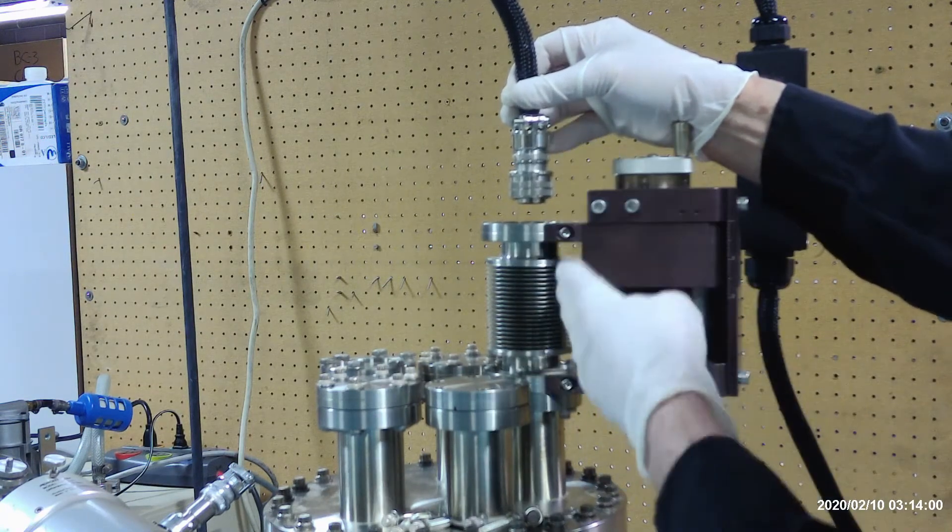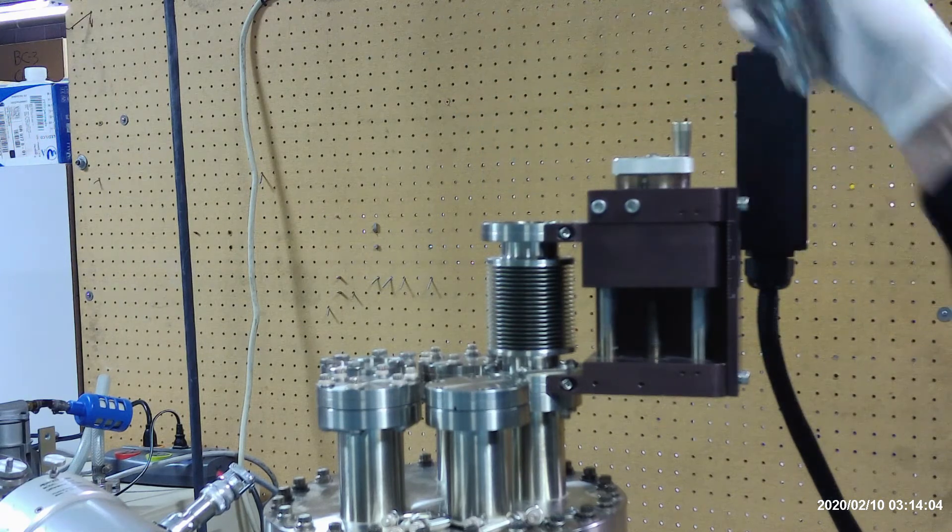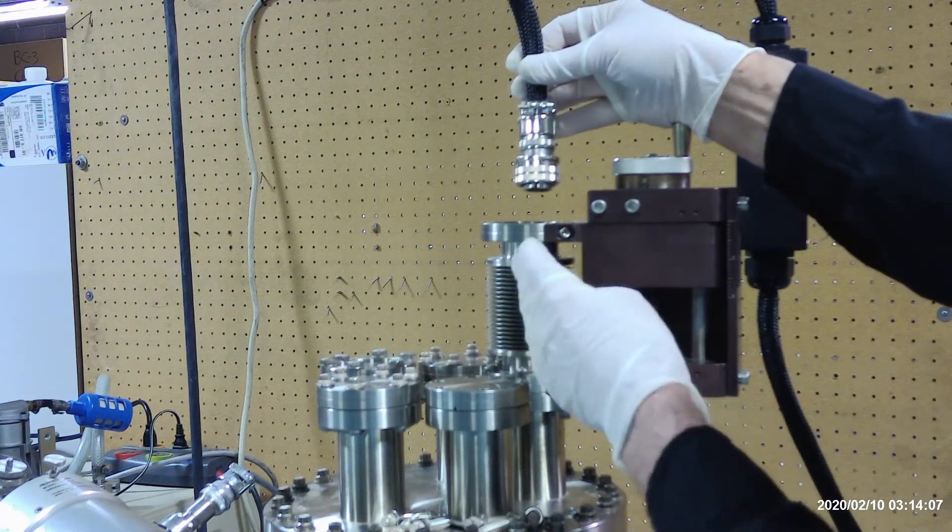When you install the analyzer, you want the key to line up as closely as possible. That way you're not putting any undue strain on the cable. We can see that the key is lined up in the front.